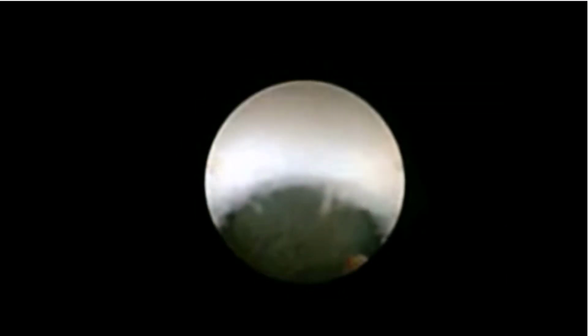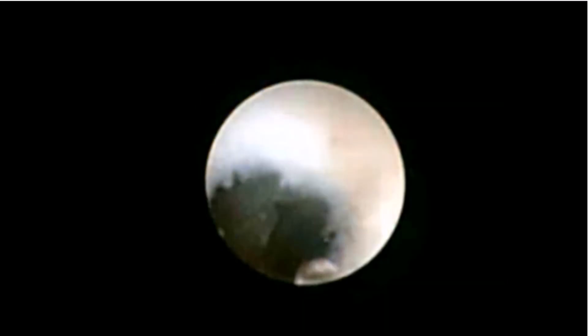We performed a lithotripsy using a holmium laser to fragment the stone.